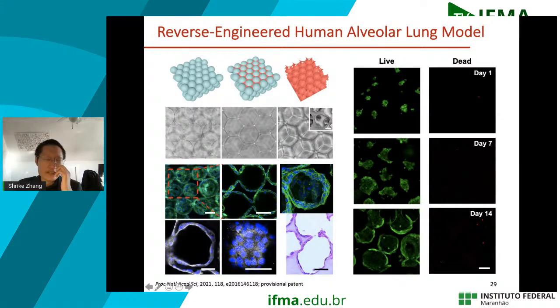So what happens here is that you have these microparticles initially made of alginate and packed together in a way that they're close packed. And then in between them, you can infill the gelatin methacrylate solution, right? Basically GelMA solution in there. And then after you cross-link the GelMA solution, you're going to form a scaffolding system in between these particles, and you can selectively remove these alginate microparticles as templates, and then you have the hollow spaces like the sacs built within the scaffold, and between the sacs, you can also have the interconnections that allow gas exchange in there, as you're seeing in this SEM image, right?